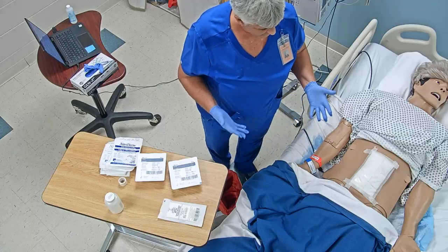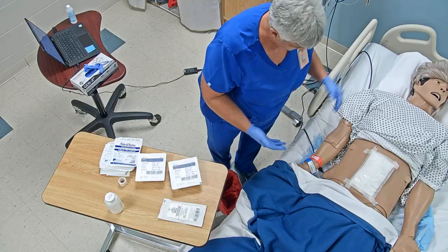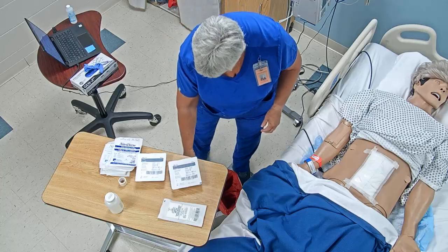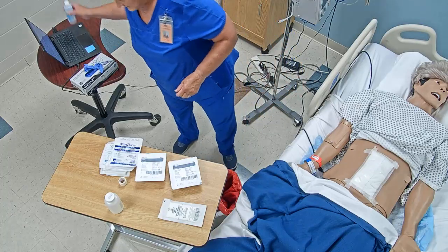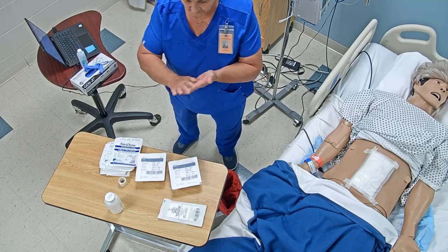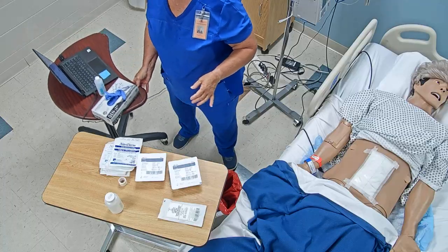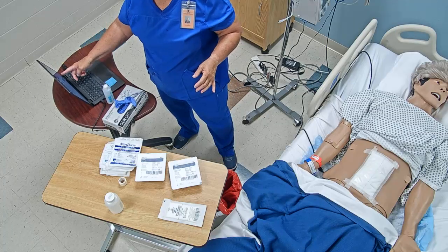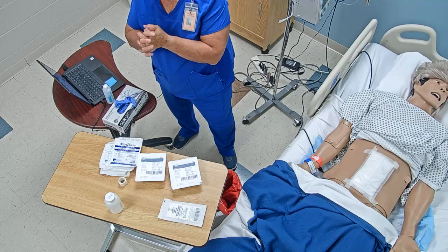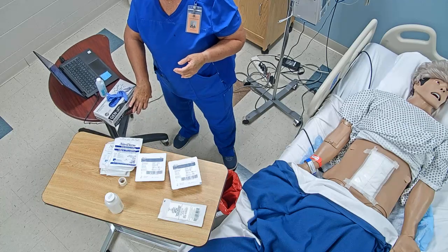Okay, so now that I've positioned, I don't want to take that dressing off with these gloves because I don't want to cross-contaminate potentially, so I'm going to take these gloves off, glove to glove, skin to skin, and I'm going to do my medical hand wash. And like I said, we're going to be doing a dry dressing change on your abdomen, and what we're going to be using is 0.9% sodium chloride to do that.